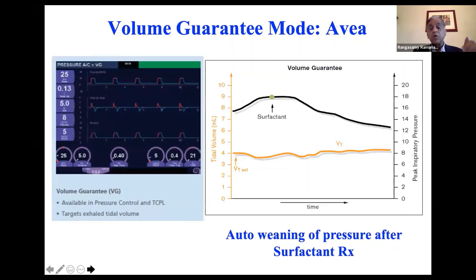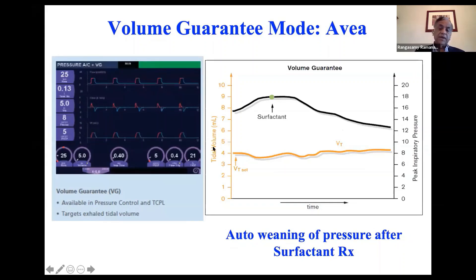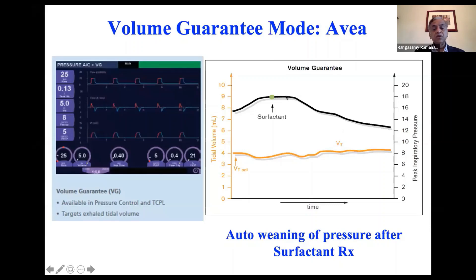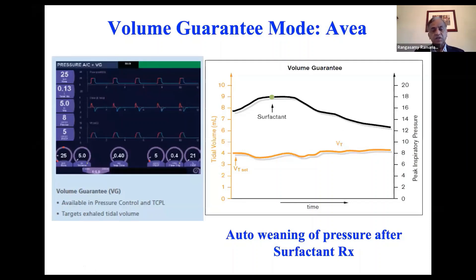This is the Servo I ventilator. You can see the tidal volume axis here in the volume guarantee mode. Here is the tidal volume — you set it at four ml per kilo. This is the PIP. Before surfactant, the ventilator was using about 18 centimeters of PIP (peak inspiratory pressure). Once surfactant is given, lung compliance improved and the ventilator automatically decreased the PIP. Now it's using 13 centimeters of PIP to deliver the same tidal volume — around four to 4.5 ml per kilo. That is how the ventilator works with volume guarantee mode.